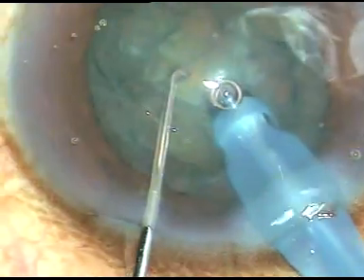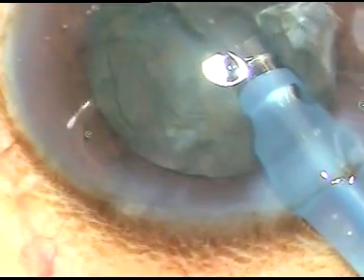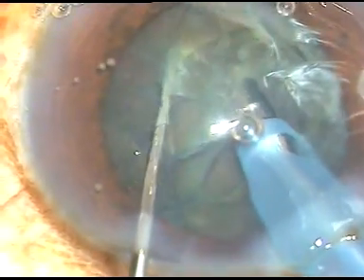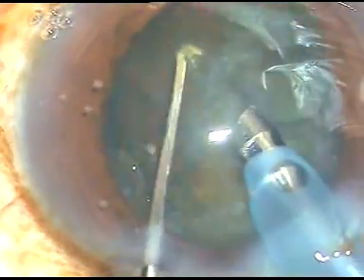Now here it is. I engage the teeth, keep it there, and slice the nucleus. If I try to hold the nucleus, I will not be able to hold it because the lens matter is soft — as I apply vacuum, it will come off and get aspirated. So I just engage the teeth and bring the chopper from the equator towards the tip, and thus I can slice the nuclear mass into fragments.